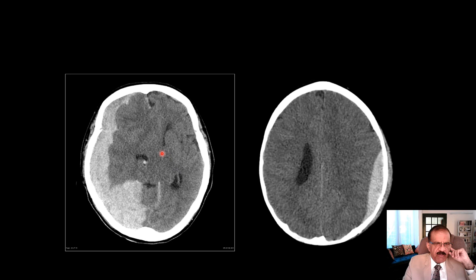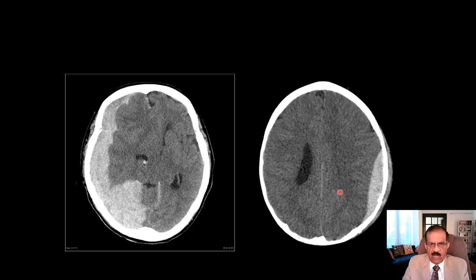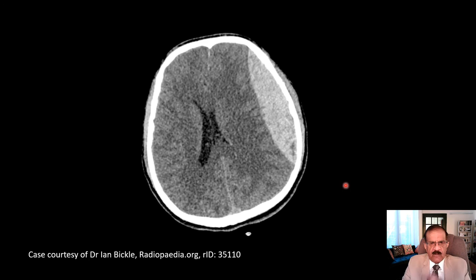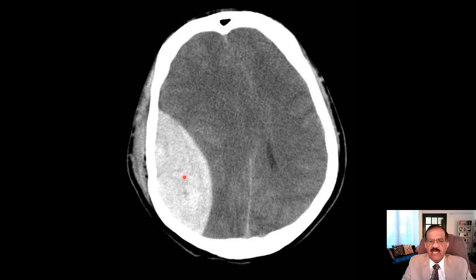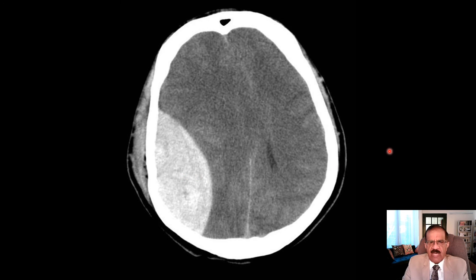There is evidence of raised pressure in both types — midline shift visible here. In extradural hematoma, diagnosis is usually made early because there is a history of head trauma leading to X-rays and CT scan. Extradural hematomas are usually diagnosed early as compared to subdural hematomas, which may remain undiagnosed for several days.